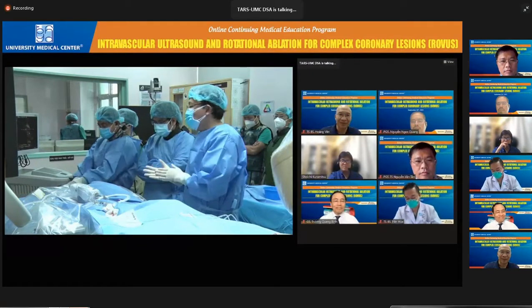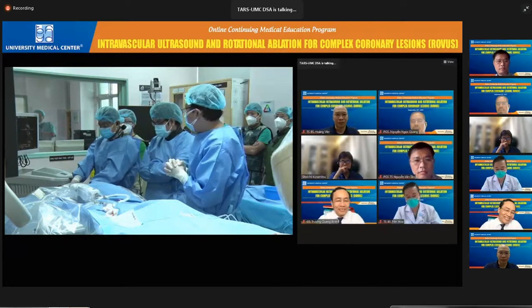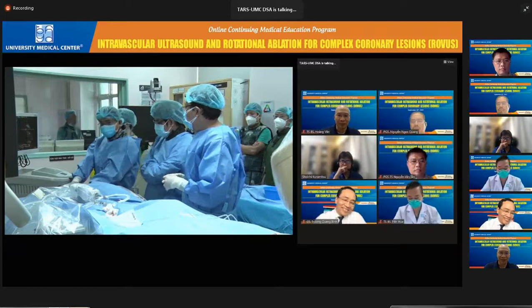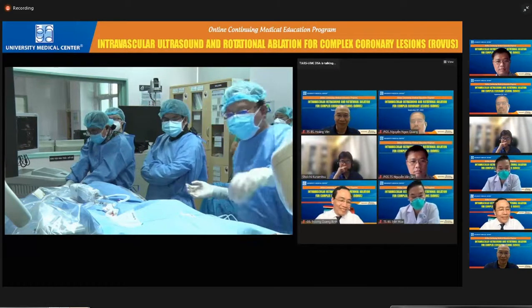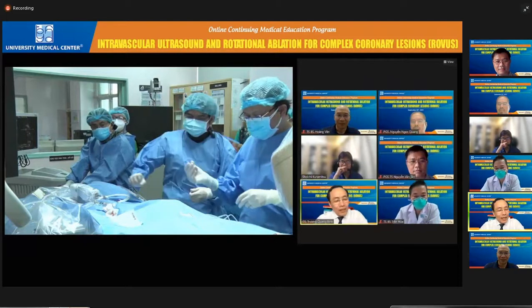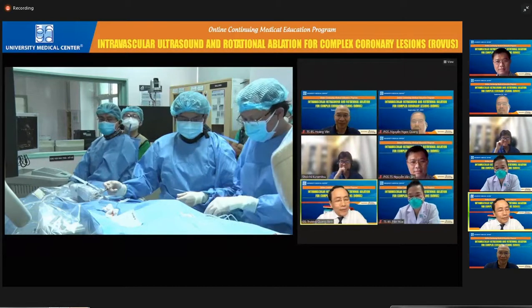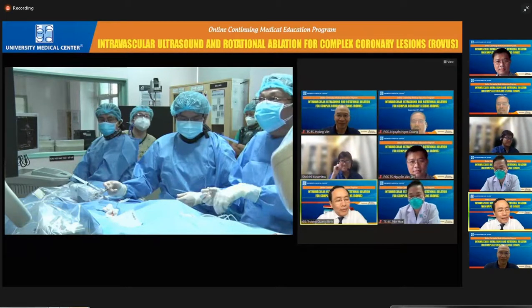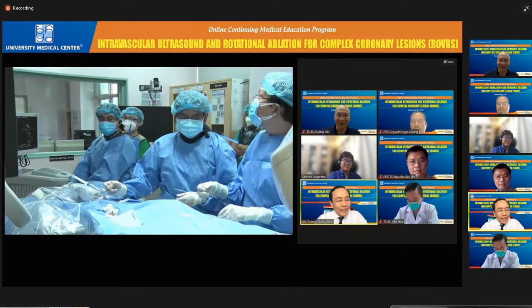And how about the chairman, the moderator? What do you think? Would you like me to do the DK crush or just one-stent provisional for this case? The majority of the panelists agree to do the one-stent technique, but it depends on your experience. If you have a lot of experience with DK crush, you can do it now.